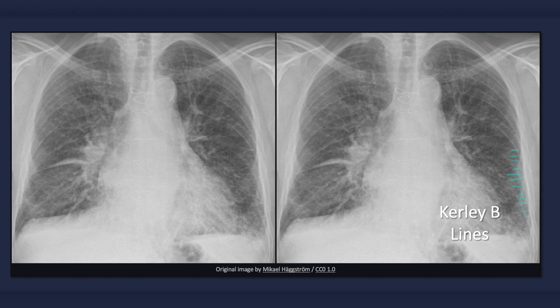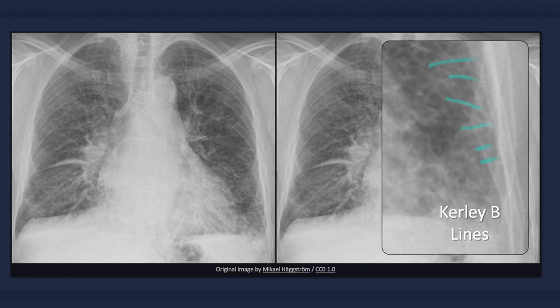Kerley B-lines are fine linear opacities that are only 1 to 2 mm in width. They are typically located peripherally in the lower lung fields near the costophrenic angles. When viewed close up, they can be seen to extend perpendicularly inwards from the pleura and are up to 3 cm in length. These opacities can also be seen head on, in which case they are referred to as Kerley C-lines, or radiating outward from the hilum, in which case they are called Kerley A-lines.